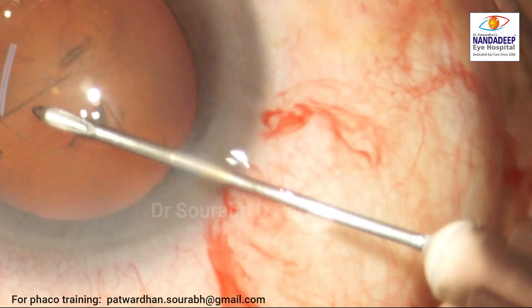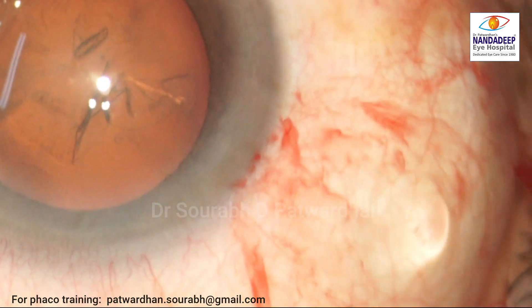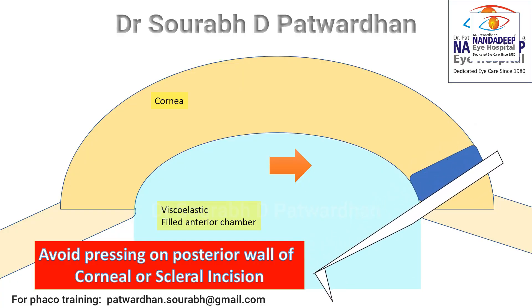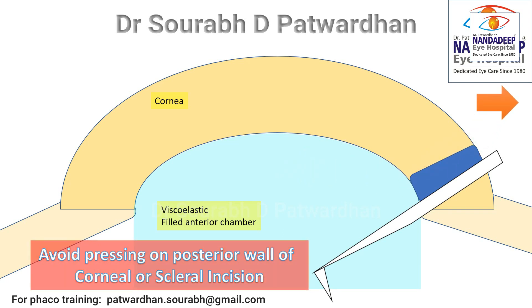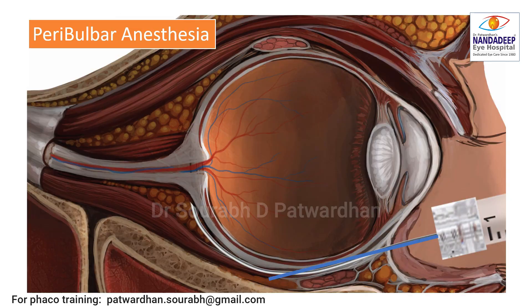I have already explained the basic principles when you are using the main incision for doing capsulorhexis, either with forceps or with cystitome. You cannot press the posterior lip down. If you press the posterior wall of the incision, the visco is going to leak out. Of course, here I am not doing that, so there is some other reason for this.